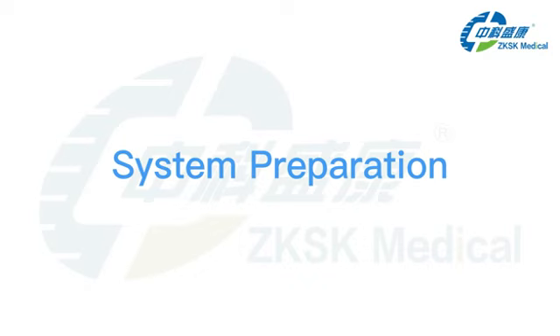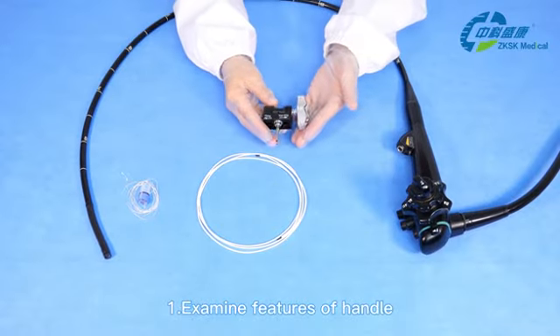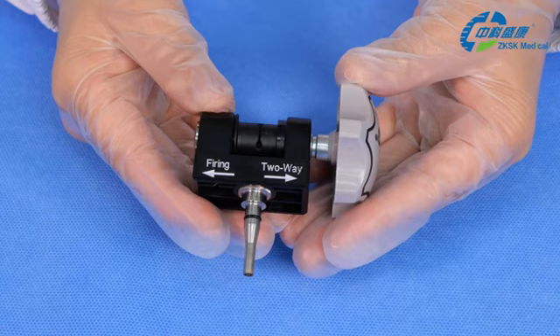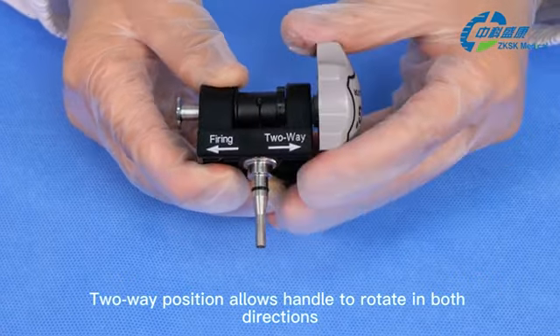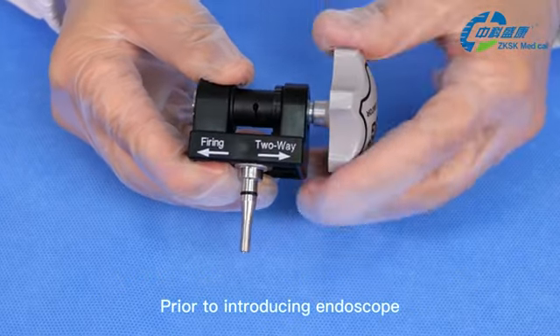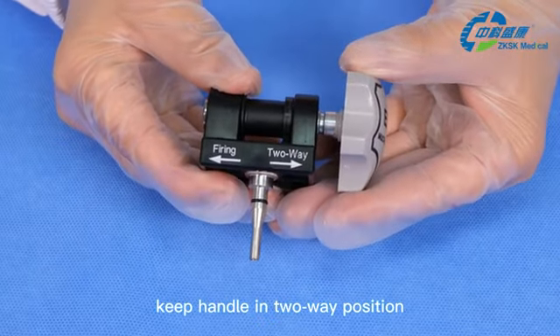System preparation. First, examine features of the handle. It has two positions which control rotation. Firing position allows the handle to be rotated in the forward direction only. Two-way position allows the handle to rotate in both directions. Prior to introducing the endoscope, keep the handle in the two-way position.